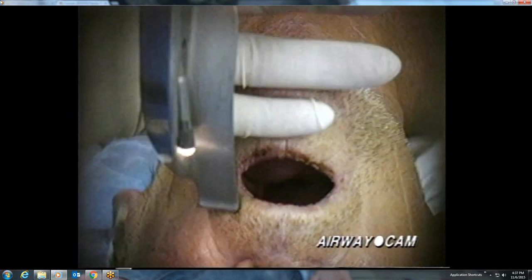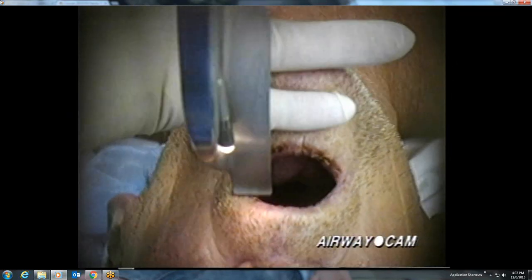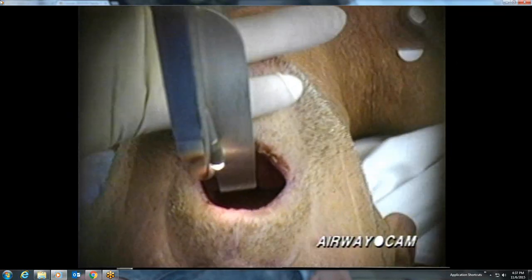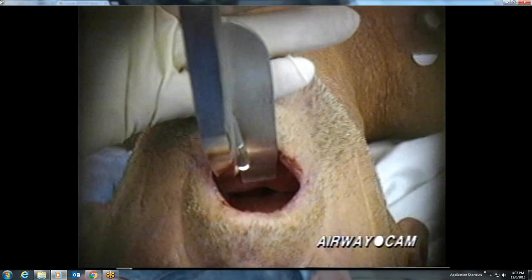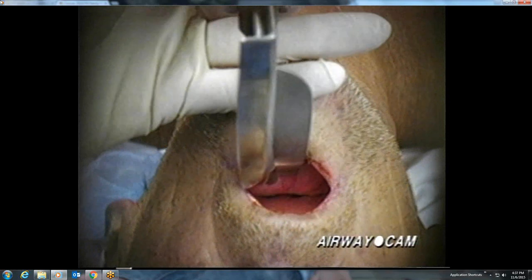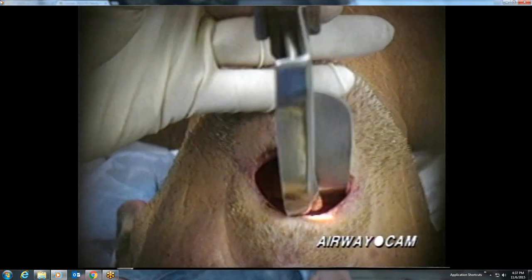Alternatively, the fourth and fifth fingers of the left hand can push open the chin while holding and inserting the laryngoscope.